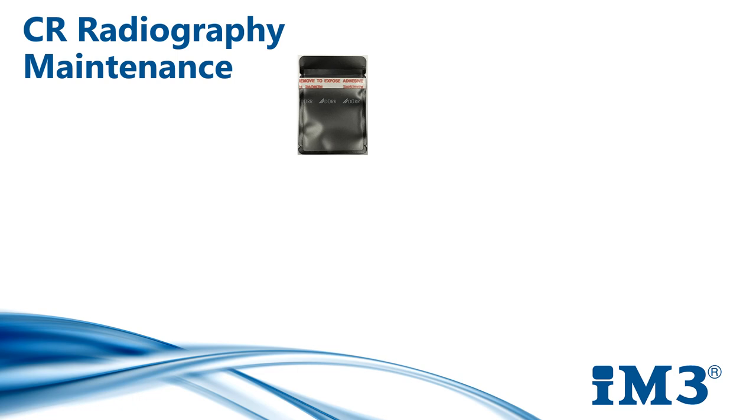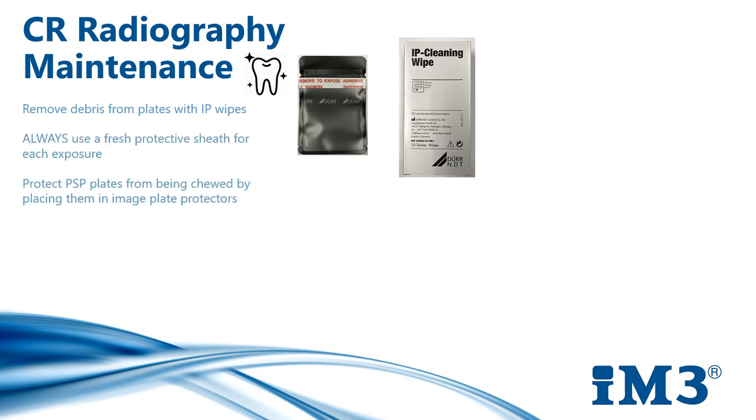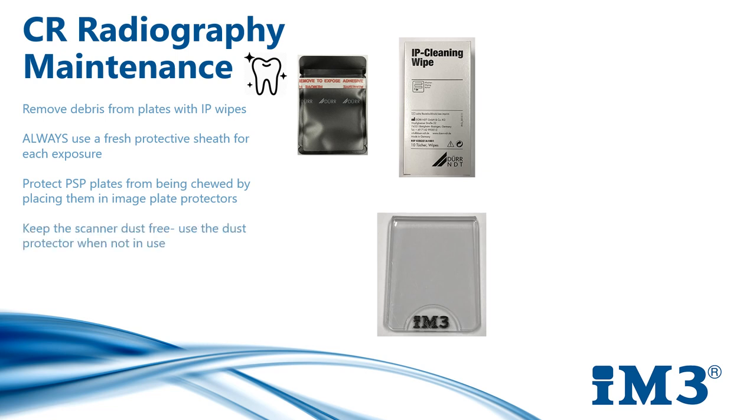I often get asked how long the phosphor plates will last, but this really does depend on how well we look after them. We need to clean the plates with IP cleaning wipes to remove any debris — any blood or debris on the plate will result in artefacts on the processed image. We must always handle the plates by the very edge and use a new protective sheath for each exposure and a plate protector to prevent the plate from being chewed. Badly damaged plates should be replaced; however, they are relatively inexpensive in comparison to replacing a DR sensor — a new plate is approximately £150 where a new DR sensor would be several thousand pounds. Always pop the dust protector back on the CR7 processor when it's not in use and clean and disinfect the input unit regularly.